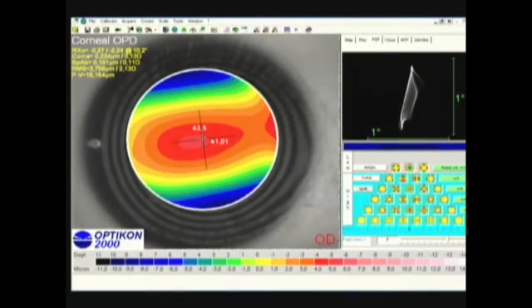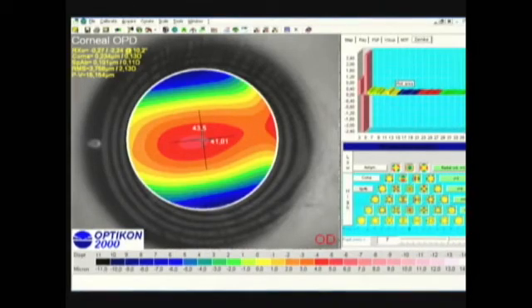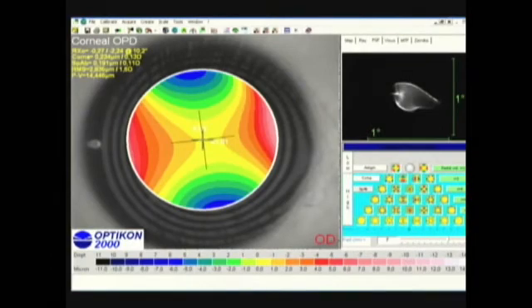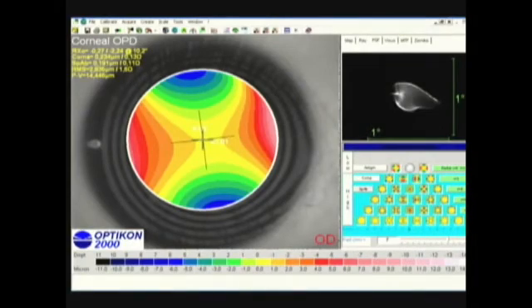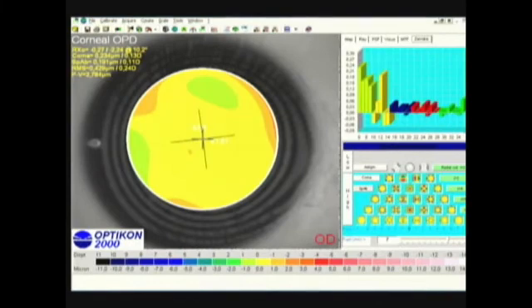And we can select which of the aberrations we correct. So here is the component of the spherical and the astigmatism, and we say, okay, let's correct just the defocus, the myopia. Well, not much improvement. Let's correct myopia and astigmatism. Well, it's better, but we still have a diffuse point. Okay, now let's go with the high order aberrations.